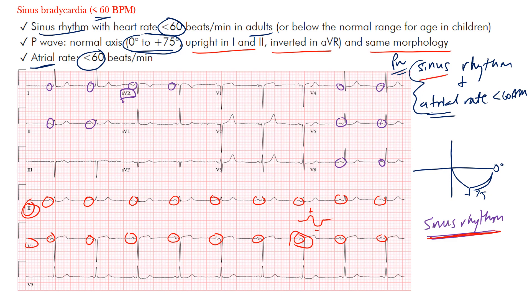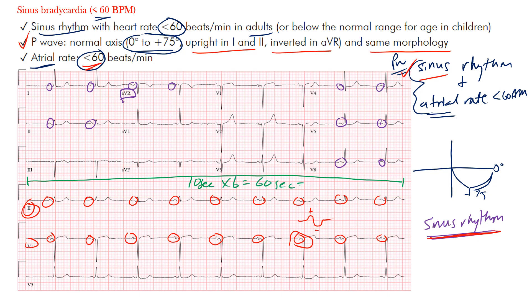So we know sinus rhythm is present based on what we saw — check that off. Now we need the atrial rate to be less than 60 beats per minute. To find the atrial rate, we use those P-waves. The standard 12-lead ECG is 10 seconds in duration; multiply by six and you get 60 seconds, one minute. Count the number of P-waves across and multiply by six to get the atrial rate in beats per minute.